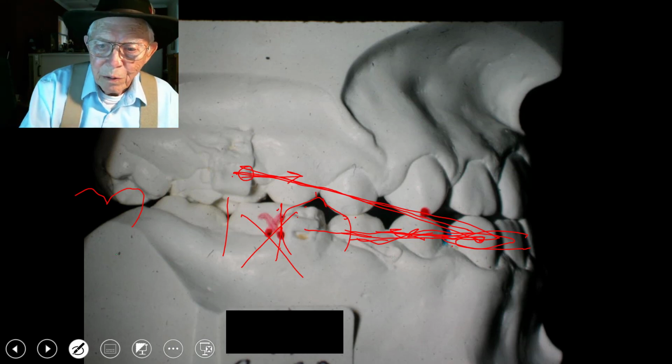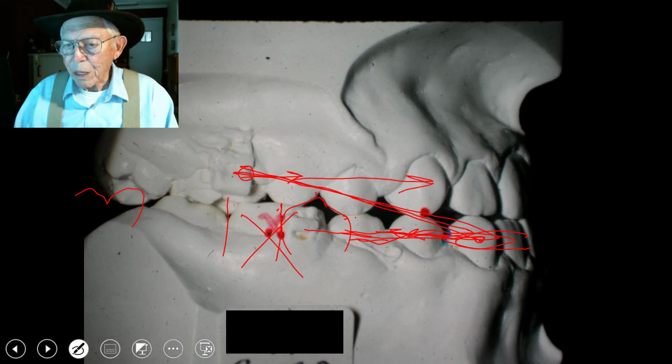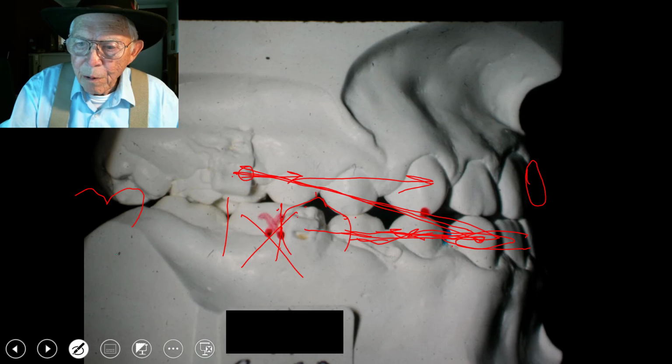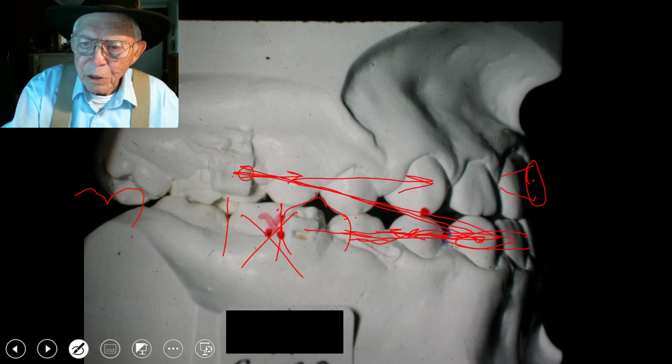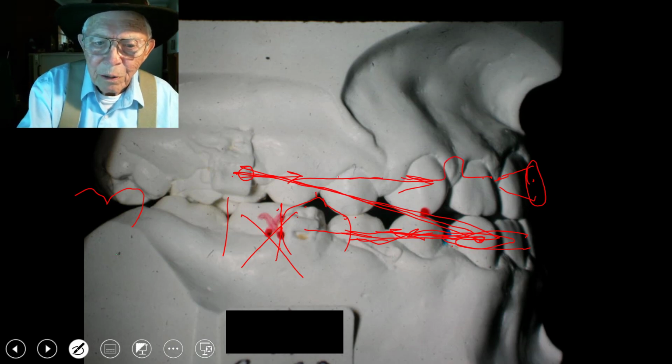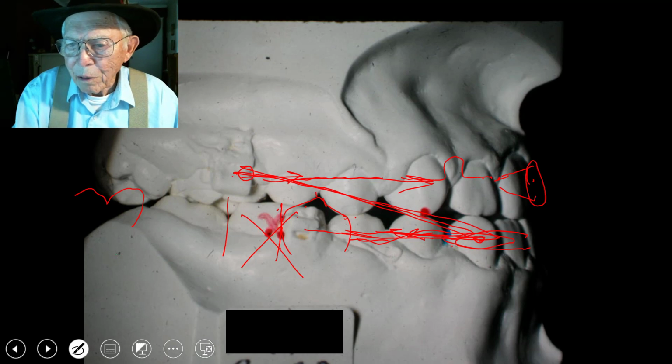We'll have the upper teeth moving forward right here at the same time. Now, on most of these, I would want to use a lip bumper that would come off something like this, and then come back in here and have an expansion loop or something like that, and come back and go into this molar back here.